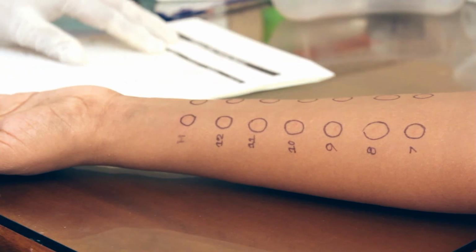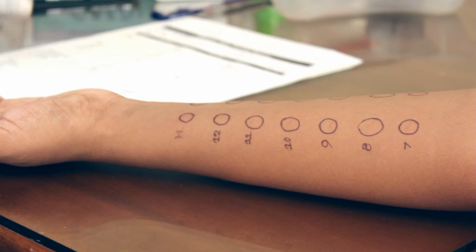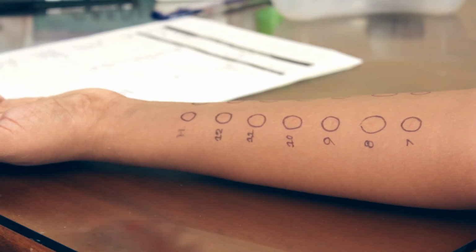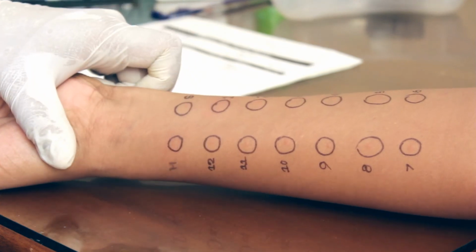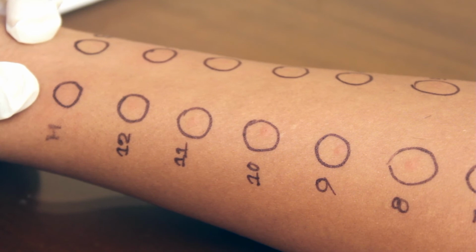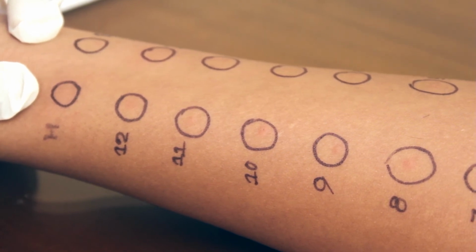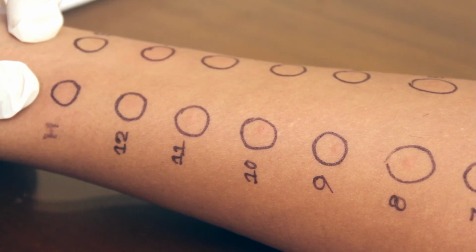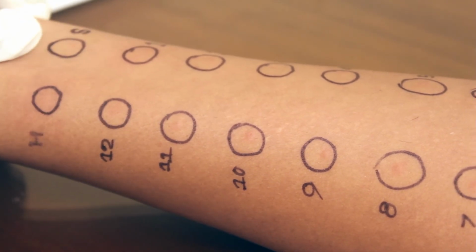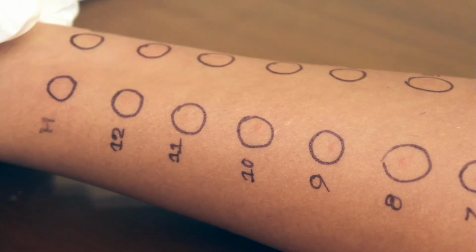I have my sheet of paper where I have marked the allergens, and the reaction is shown on the skin. First of all, you must see whether the histamine has given a positive reaction. You can see a definite histamine reaction, and the saline has to be negative. There should not be any reaction at the saline site.